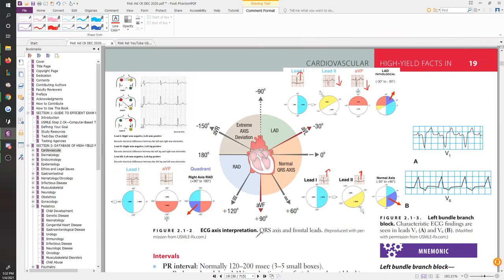Okay, the red area was supposed to be down at, they don't have the red in this area, because in this image here, they didn't put AVF. They just put 1 and 2 because that was enough to make the point. But AVF was actually supposed to be something that was more on the right side, and now it's on the bottom. And when you do the overlap with these two, you get a purple area that's pointing so far to the right side. That is a right axis deviation. That's not supposed to happen.